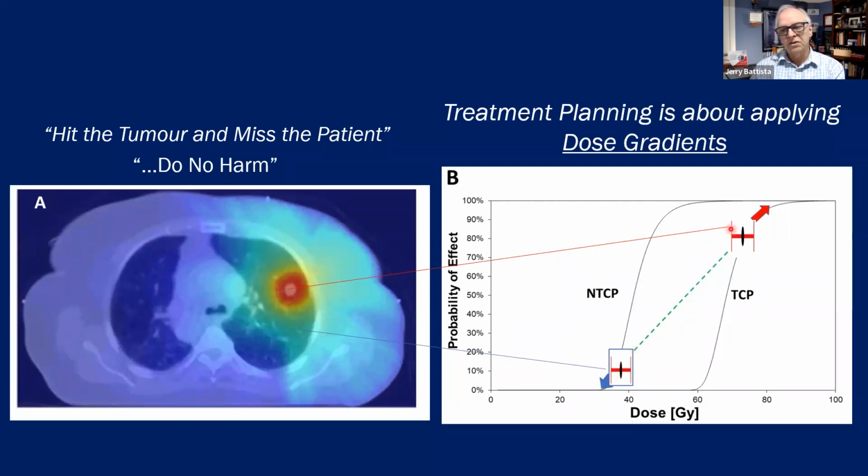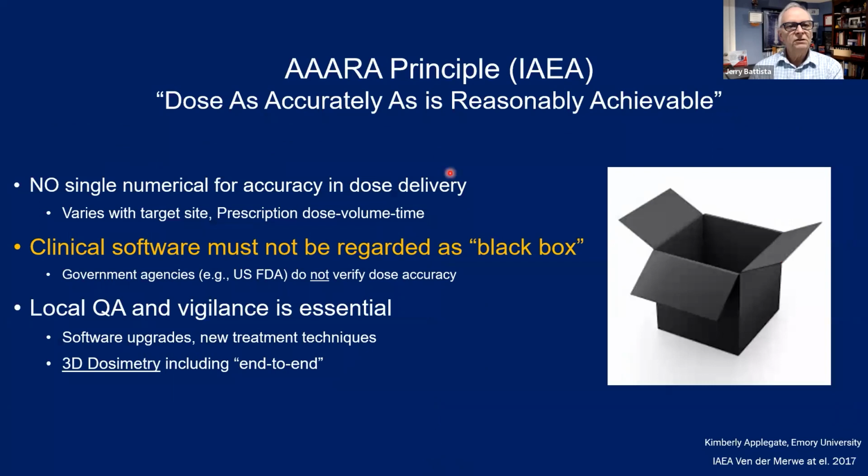And I also want to mention that we sometimes think that if everything averages out, we don't need to worry about this. But the fact is that biologically, things do not average out because these curves are not linear. It's a non-linear system.